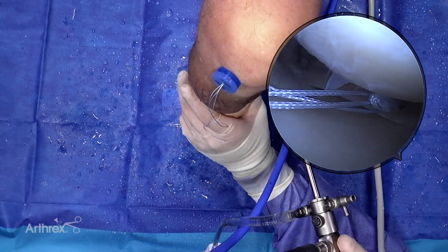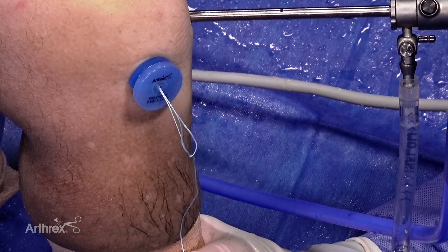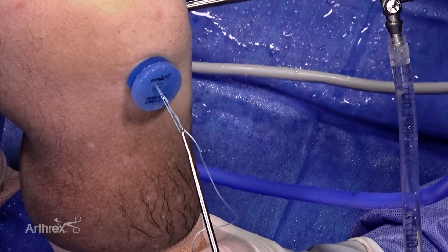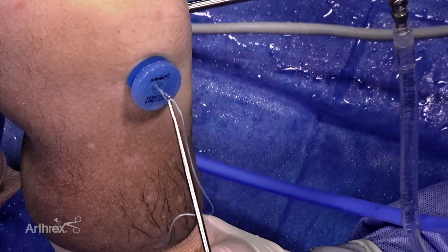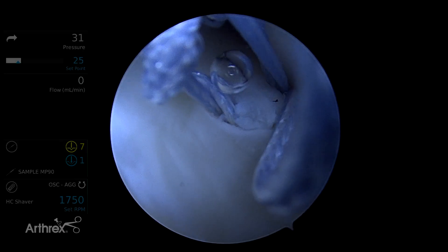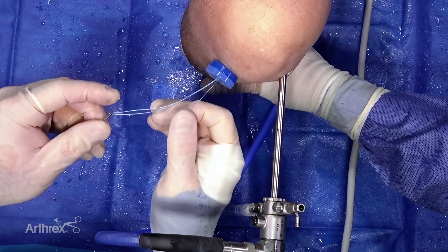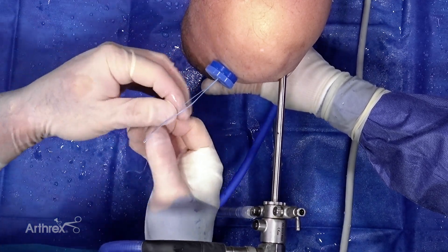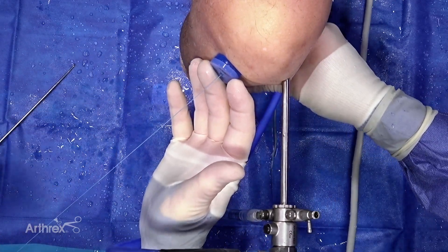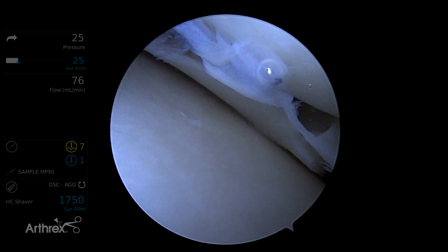Now I've got a loop and a straight suture, and you'll see they're intertwined. What you don't want to do is grab it up high — you want to grab it down low at the true end of the loop. Now we want to tighten the tightening suture across. We're going to pull the loop and hang on to the free end. That crossbar is down, so the loop has done its job. Now we tighten down this loop by pulling the straight suture — remembering that this device really is all one suture, it's just got two deployed knots in the back. Push it and cut it.